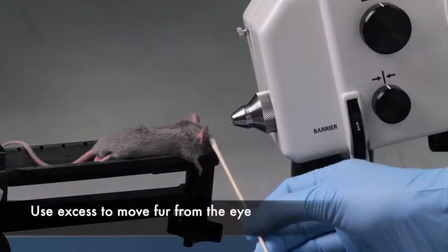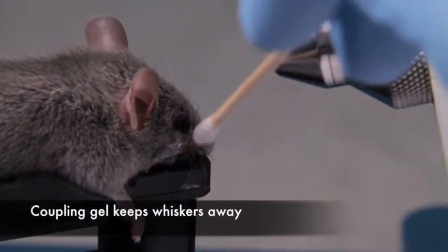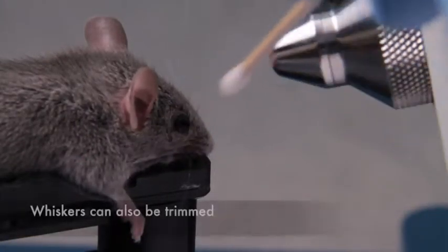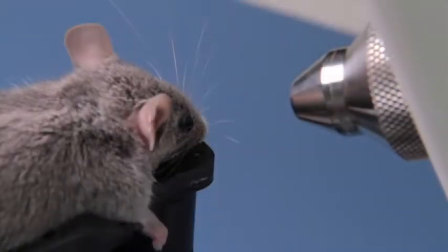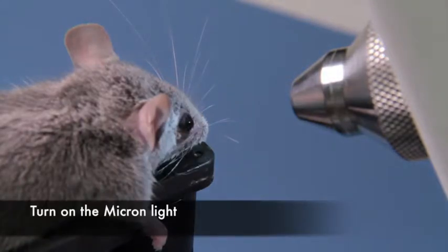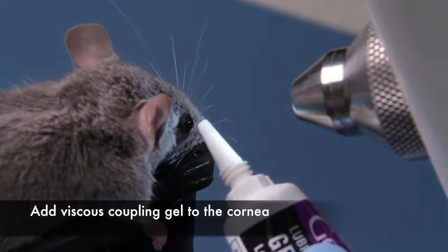Excess liquid can be used to move fur from the eye. Coupling gel can be used to keep whiskers out of the way, or the whiskers could be trimmed. Turn on the Micron light and add a nice blob of coupling gel to the cornea.